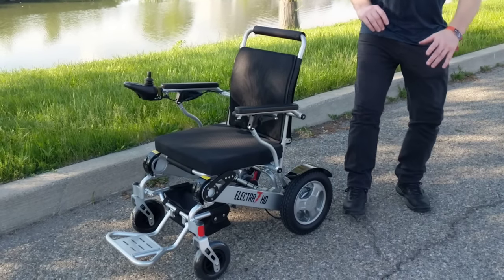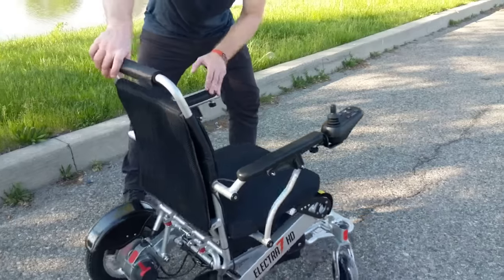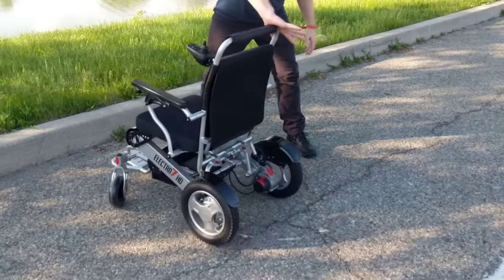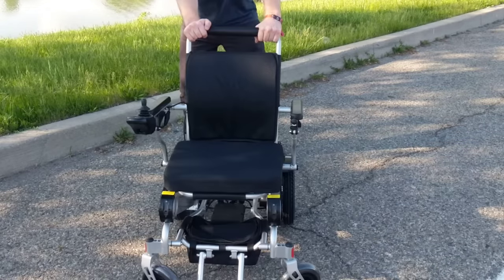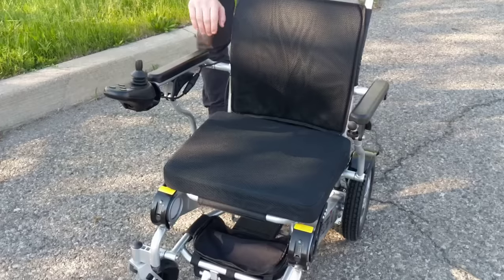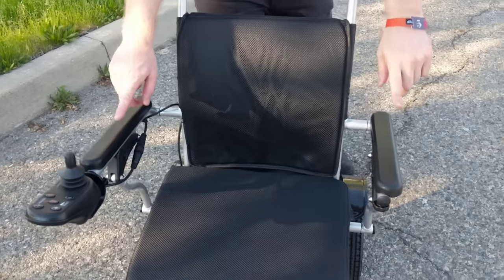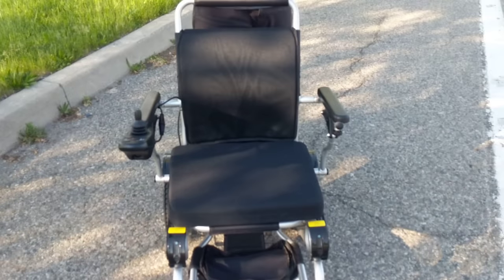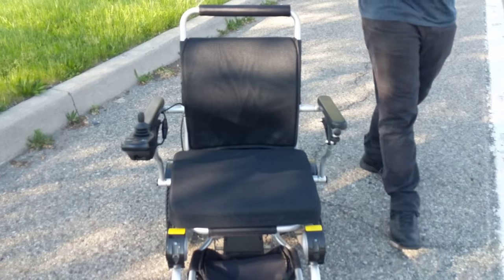First and foremost, the Electra 7, as you can see, is very easy to maneuver. The chair is in freewheel mode, not power mode — easy to work with, easy to maneuver. We're going to point out some of the features here, starting out with one of the things that makes this chair more unique than any other Power Folding Wheelchair available today.